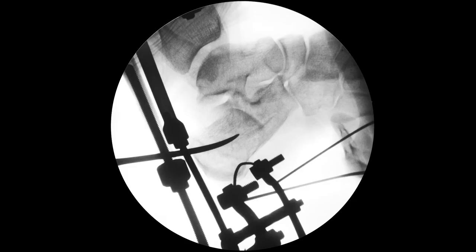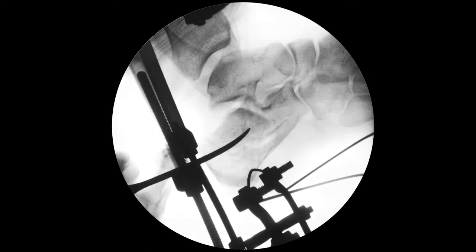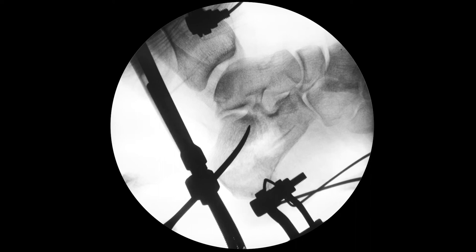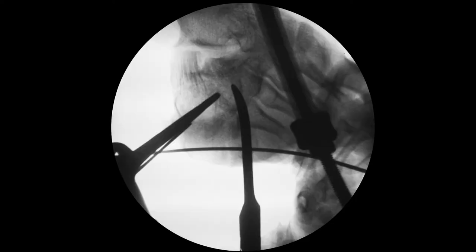Through a stab incision on the posterior surface along the lateral border of the Achilles tendon, an elevator was introduced under the articular facet and the lateral part of the joint was elevated.